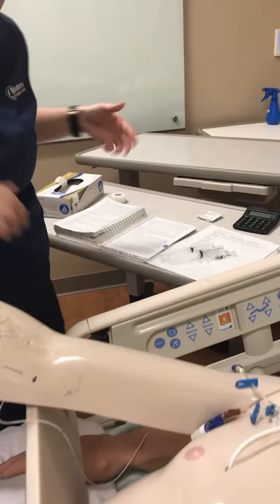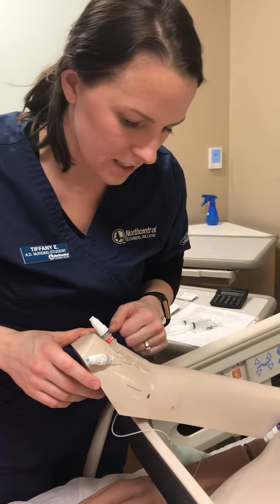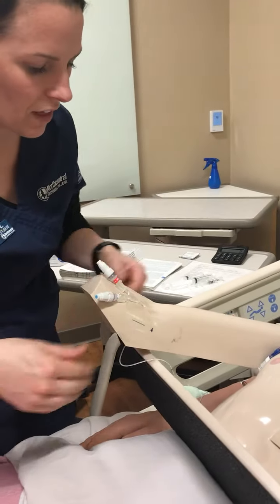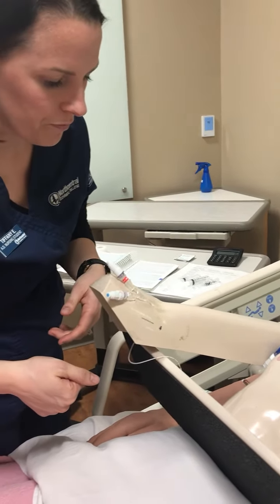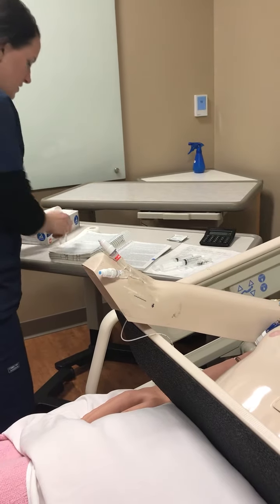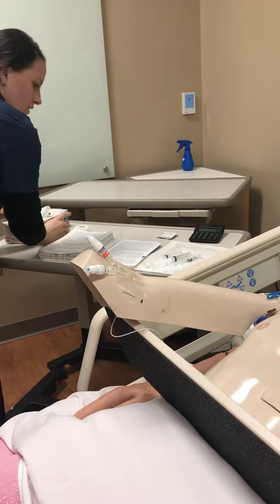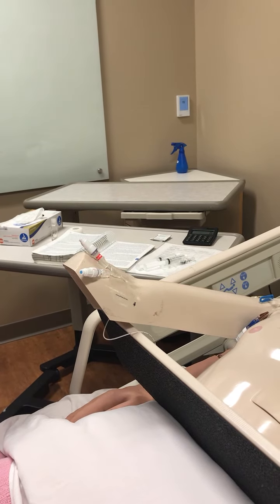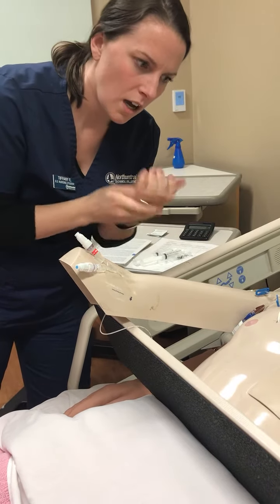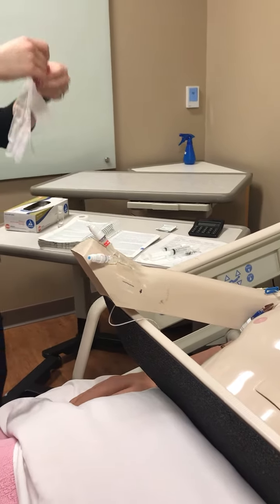Alright, and I don't see any issues with the site. It looks intact. I don't see any concerns, redness, edema, or any signs of infection at the site. So, okay, put my gloves on.